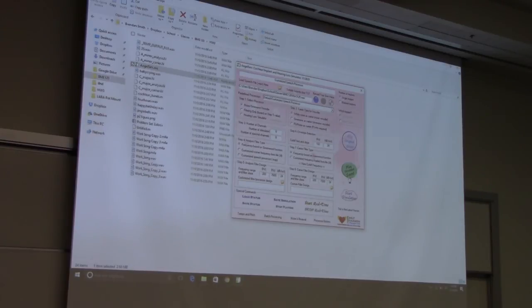So in this simulator, a few things that the homework will walk through. First of all, with these sounds, it's not like you can stick it into someone's brain and measure exactly what they're hearing. It's sort of using a little bit of engineering intuition to guess what it should sound like. This is playing what we expect it might sound like. I've heard two guesses, either that really fuzzy one or the sort of ringy metal one. The truth is somewhere probably between those.